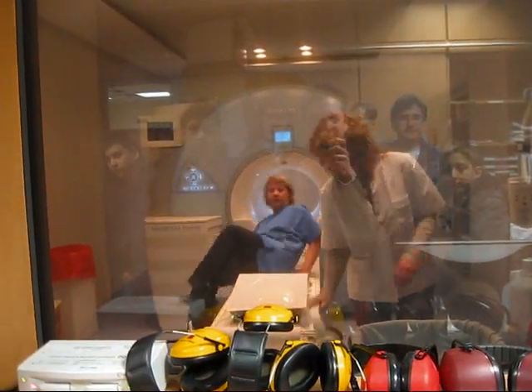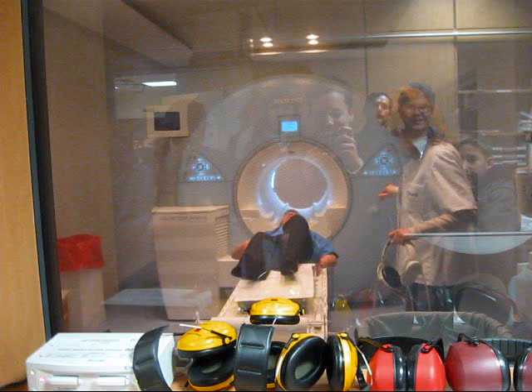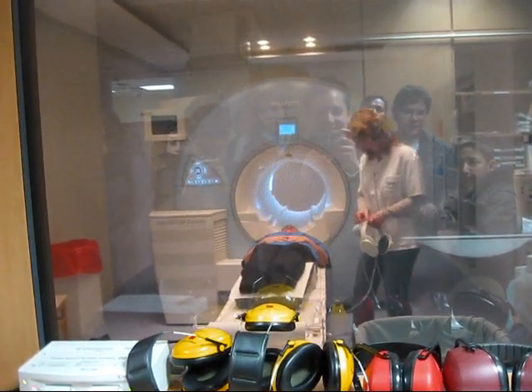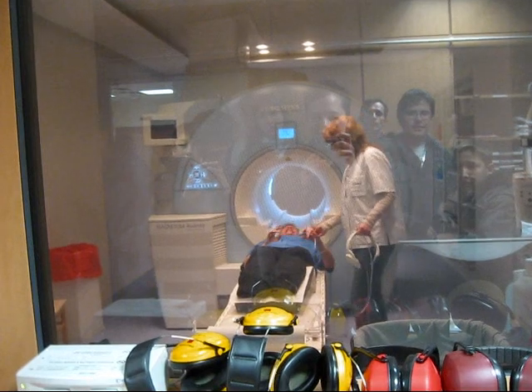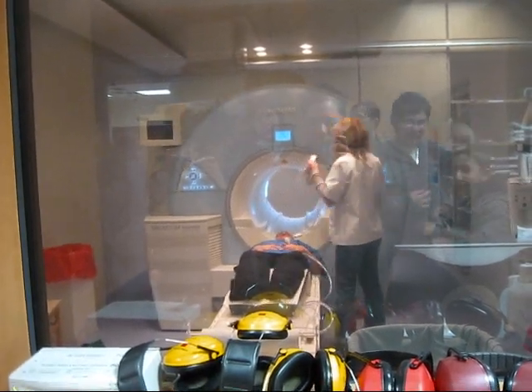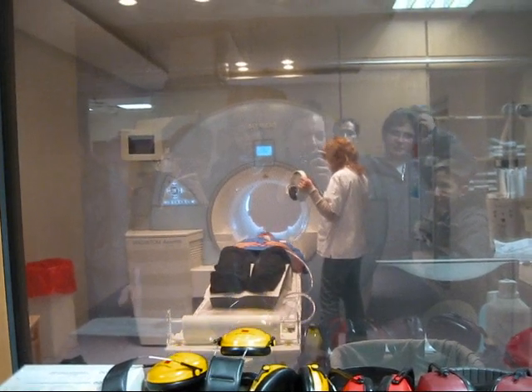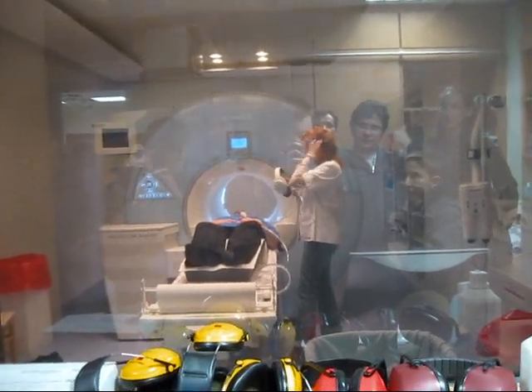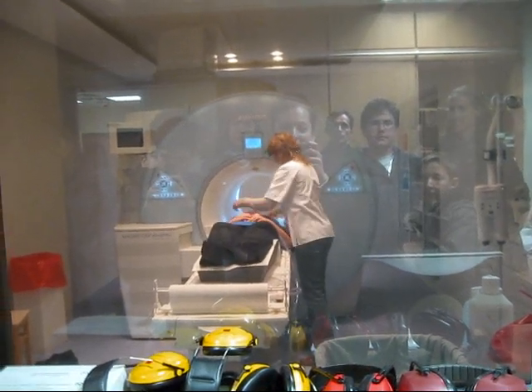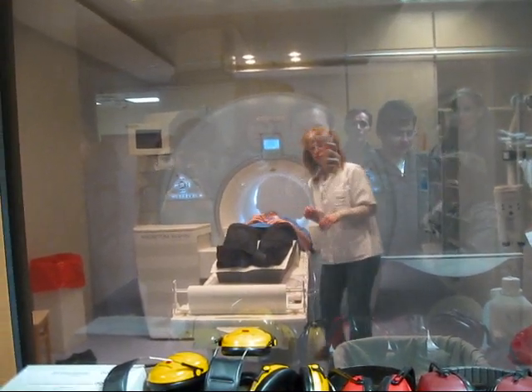This nurse has volunteered to do a full cervical spine series, which will take about 15 minutes. She is receiving a panic button that will stop the device and get her out in case she panics. She will also receive headphones because the gradient forces that pull on the coils will cause really loud noise — like a sledgehammer.